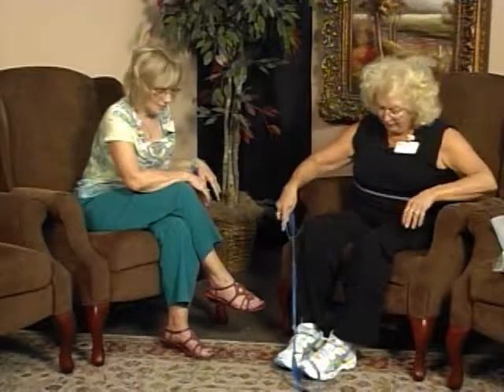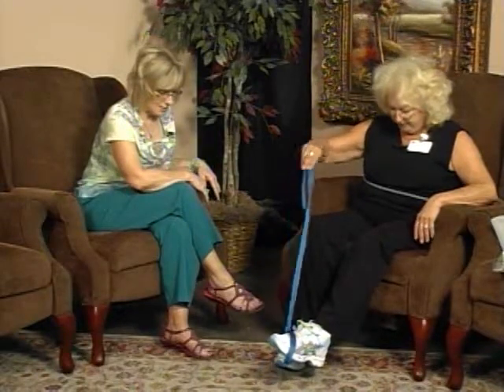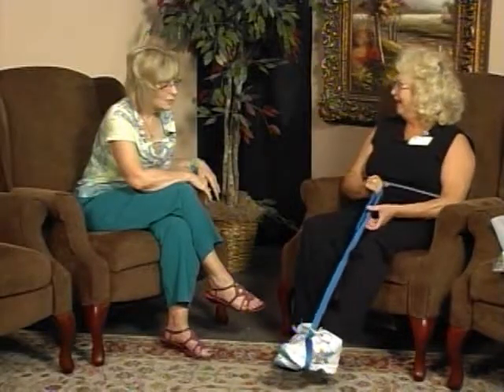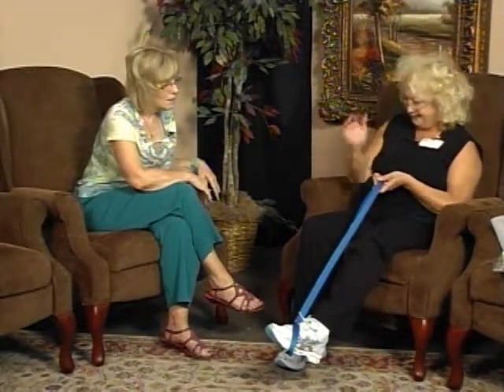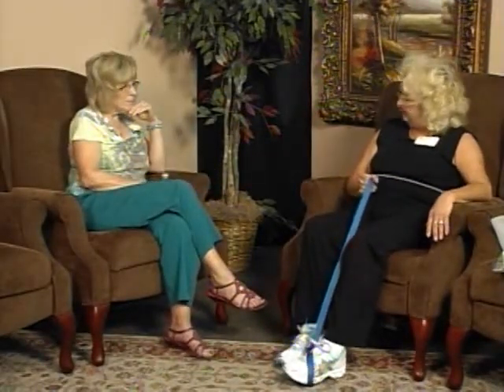Okay. But the rest, and what's your blue thing over there? We haven't gotten to the blue thing. This is one of my favorite pieces. It's a brand new one, so it's kind of not stretched out, and it's kind of holding its shape. But say my left leg is broken, and I've broke it several places, and I've got a cast on it, and it's heavy. And I can slide out of bed, and I can stand up on this leg, but I can't lift. So I'm sitting on the edge of the bed, and I want to lay down. I'm so tired. I can use my upper body strength, and I can raise my leg and then get on in bed.